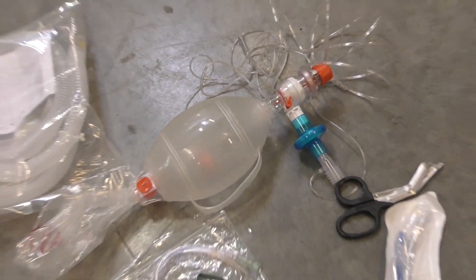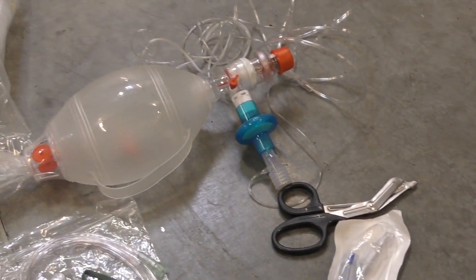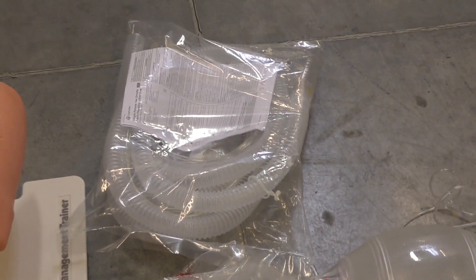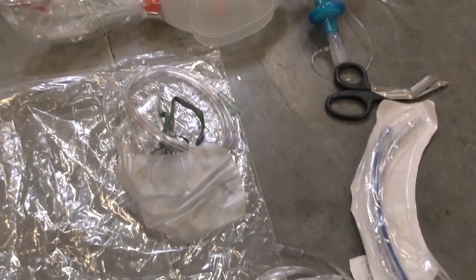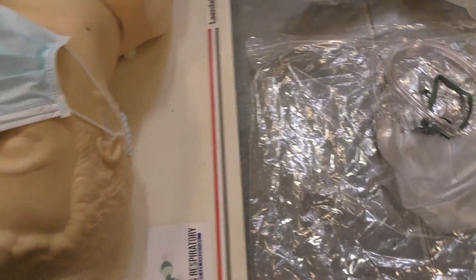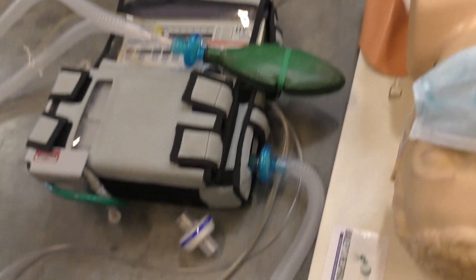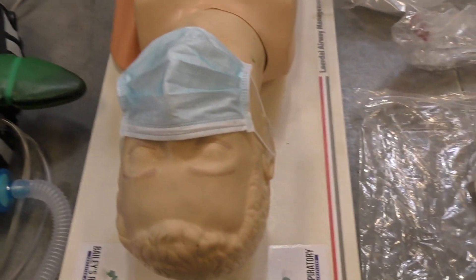I have an Ambu bag with a filter on the end of it, and I also put my end-tidal capnography on there so there's no fumbling. I also have a vent circuit — I'm going to use the bag it came in as a barrier. We also have a non-rebreather and a nasal cannula. We have our ventilator set up on a test lung, and I'll walk you through the differences we use with this type of high-risk patient.